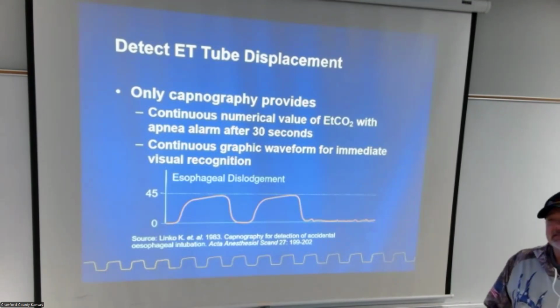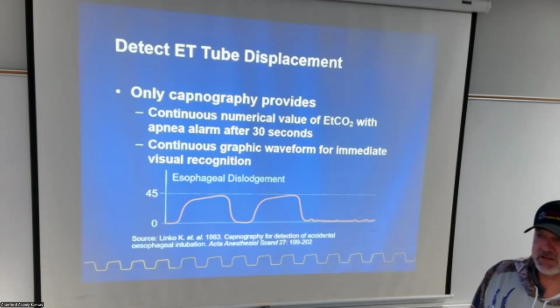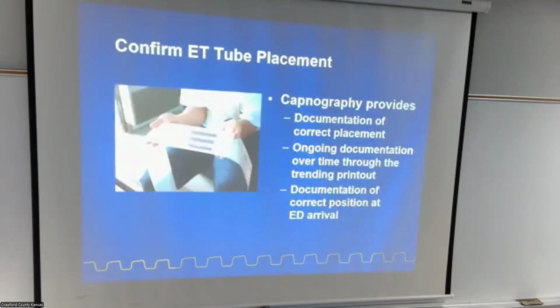When you're busy with a code or whatever it may be, or an intubated patient that's critical, you have to have that waveform. You have to have them on CO2 because your oxygenation numbers will just kill, it'll end your career in a hurry. Don't ever go off of just oxygenation alone if your patient's actually in trouble or if you think your patient's sick.